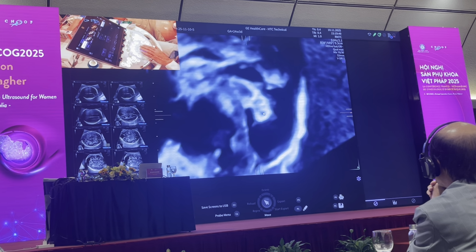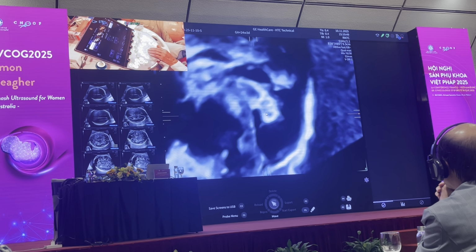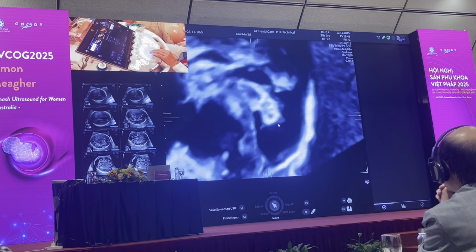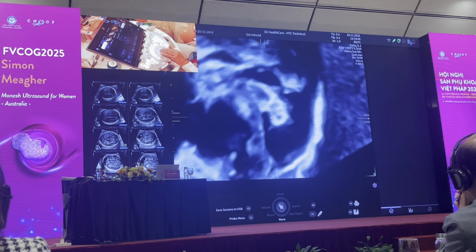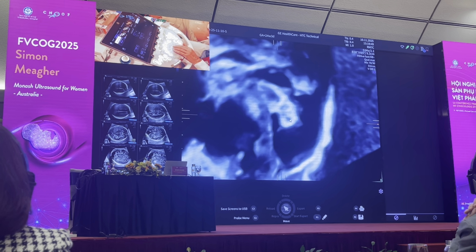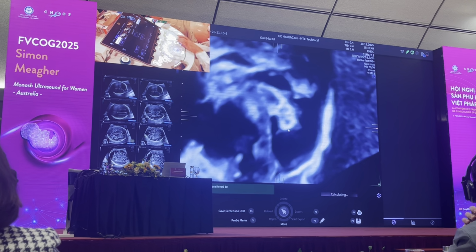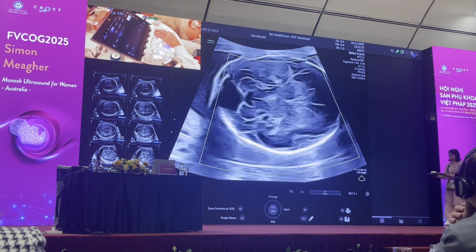Please remember that I'm not going to get as good detail as I would get with a dedicated scan in a 3D volume acquisition. But enough to say to me that when I look at this, there is some anterior compression of the vermis, but to me the height of the vermis is normal, and so is the area. But again, I would correlate this finding with an MRI.